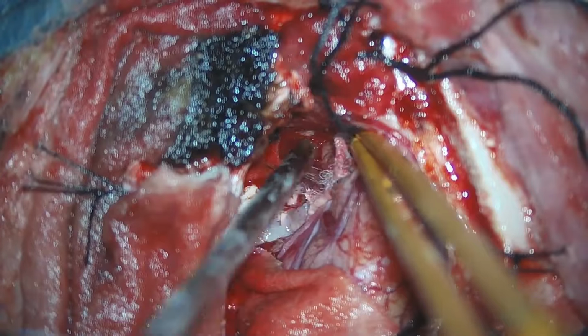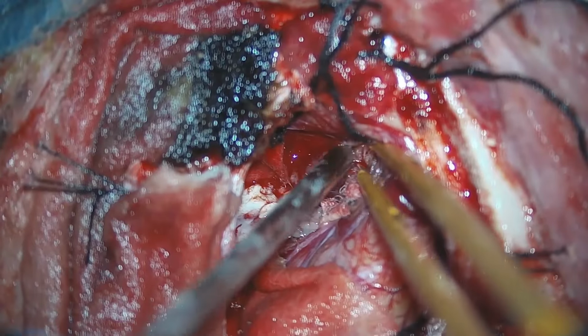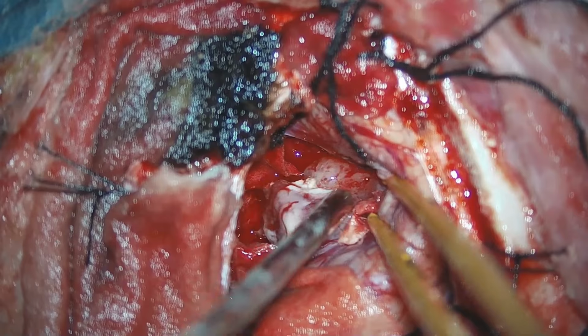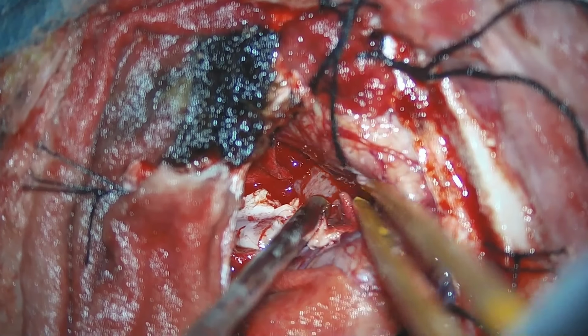So, again, we are going for debulking of the tumor. Again, some part of the tumor is being debulked, coagulated and aspirated with suction.